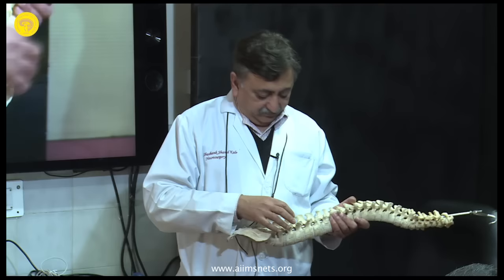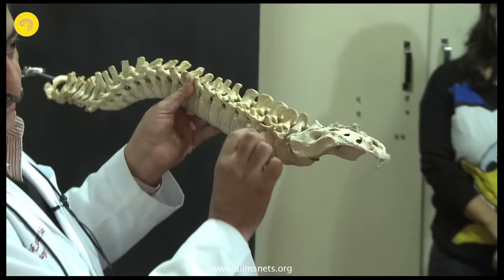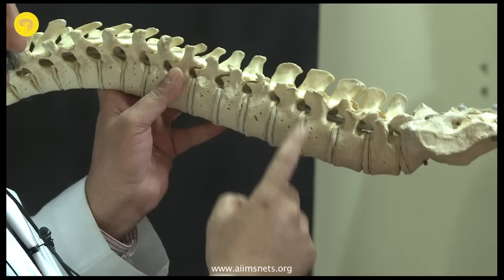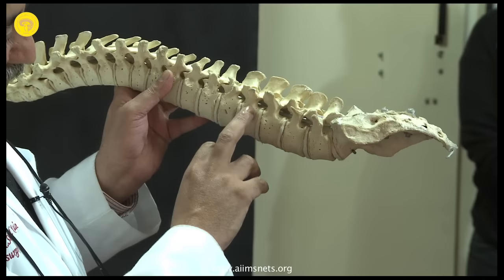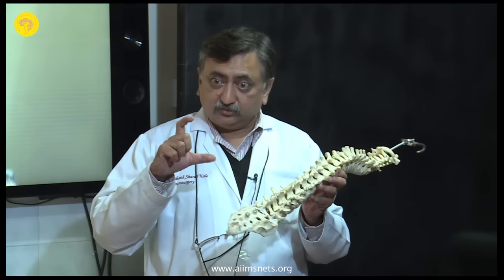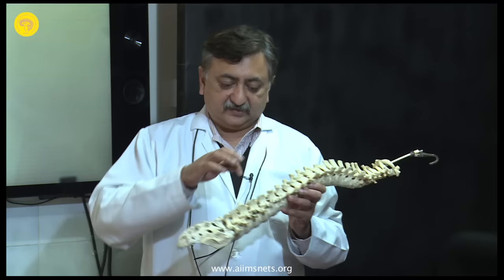Generally you have to cover 2/3 of the body. Your screw should cover at least 2/3 of the body, because you don't need a bicortical purchase over here. You don't need to engage the anterior cortex of the vertebra here, because you're going through so much cortical bone in the pedicle that it's a very stable fixation. So as long as you have covered 2/3 of the body, that's the length of the screw you need. Screw, which excludes the head of the screw. Just the screw should be that length which you measure, starting from your hole to the end, at least 2/3 in the body.